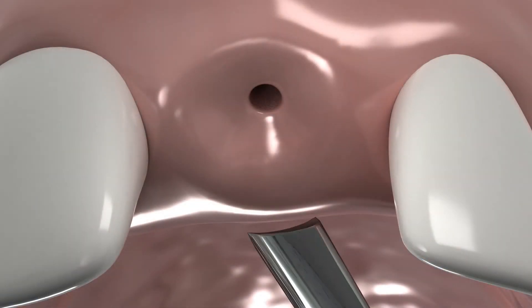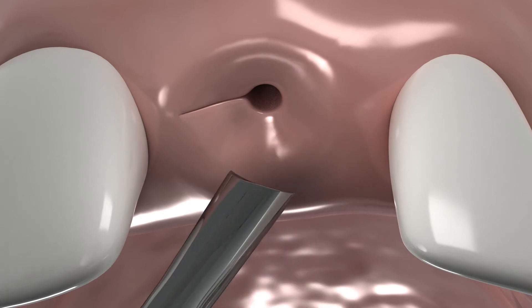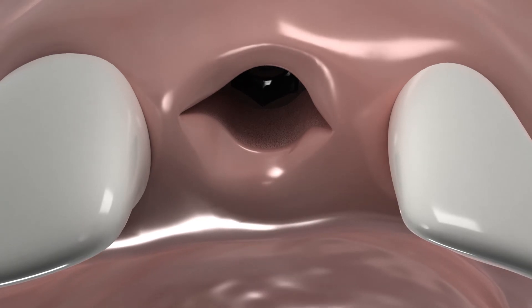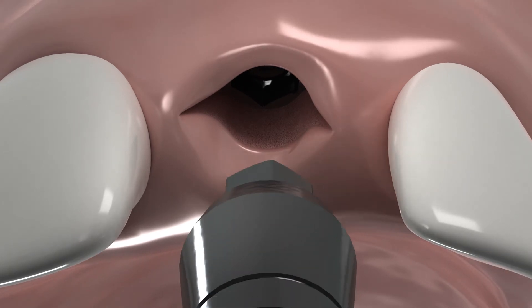Then, use a gingivectomy knife, or a scalpel, to make release cuts on the mesial and distal sides of the gingival opening. Adjust the release cuts to the abutment diameter.